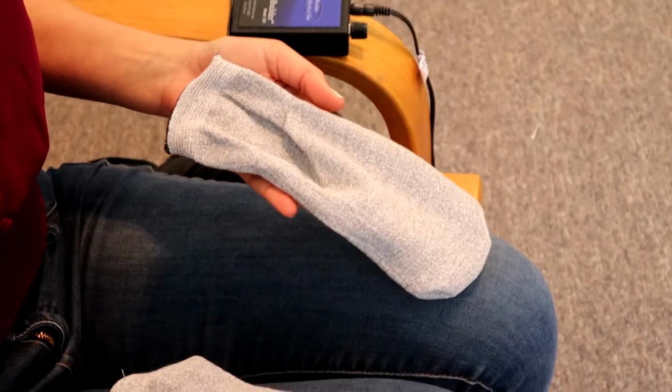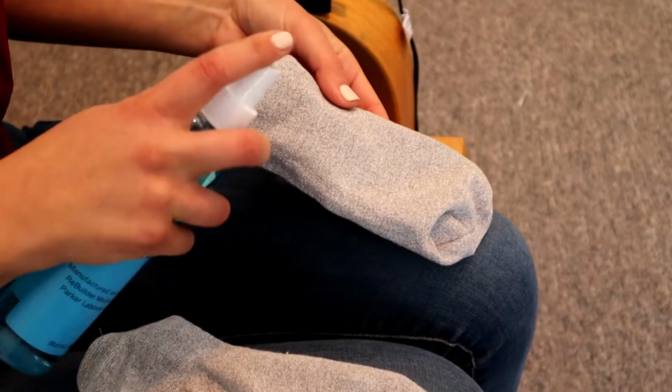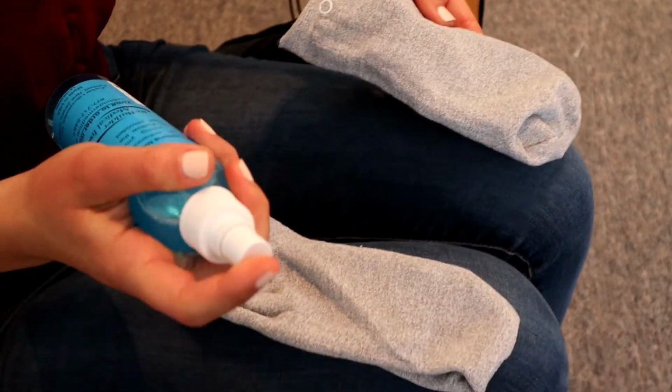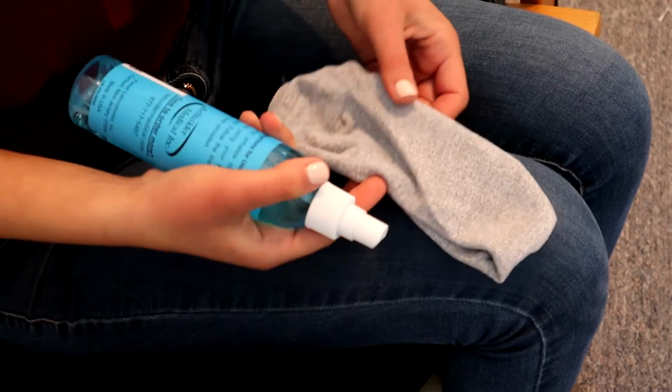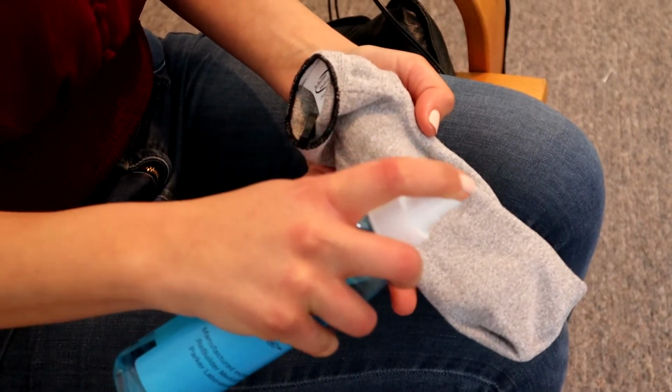Now turn the socks inside out. Spray the ReBuilder electrolyte evenly across each sock until the fabric is moist. More spray can be added if desired to enhance conductivity. When finished, turn each sock right side out.